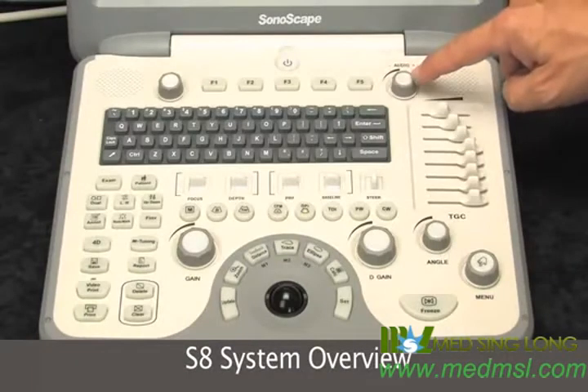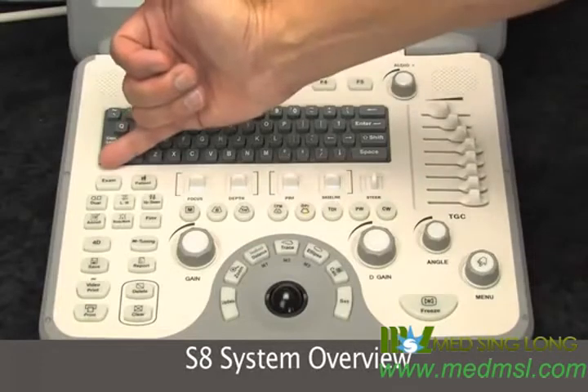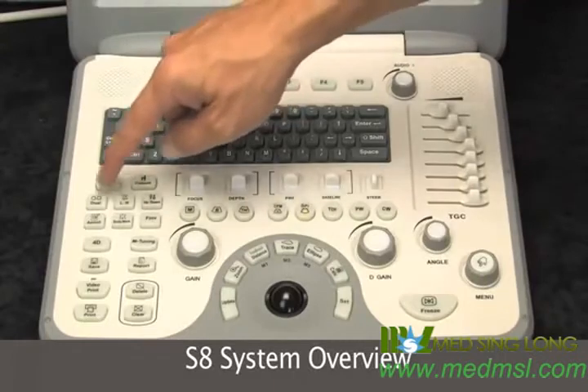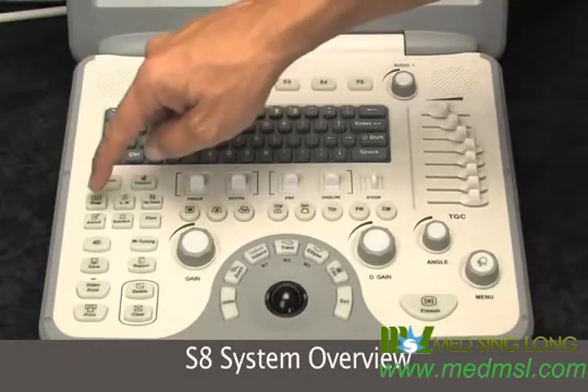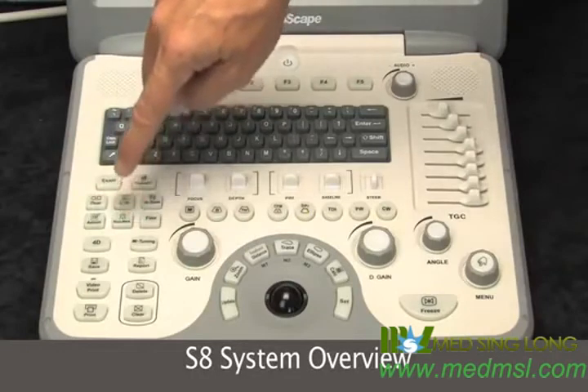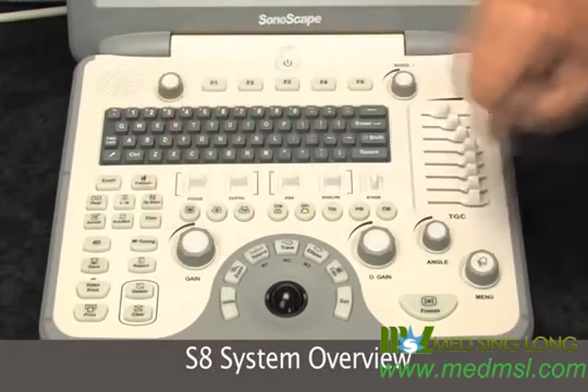This is your overall audio output of the instrument. We begin by selecting our exam type, we enter our patient name, and we have our image orientation — left, right, up and down, dual. This is our annotation and our body markers, and flow invert, which is associated with your spectral and color flow Doppler.